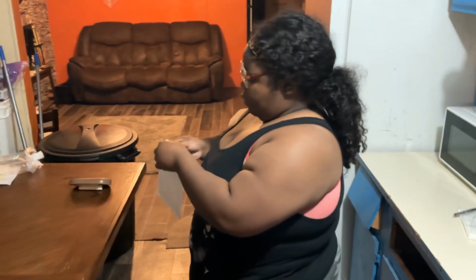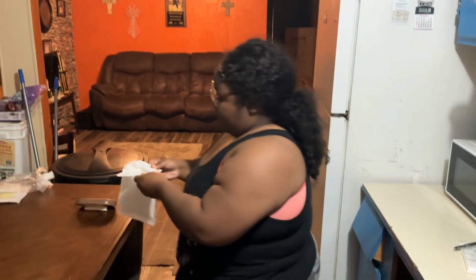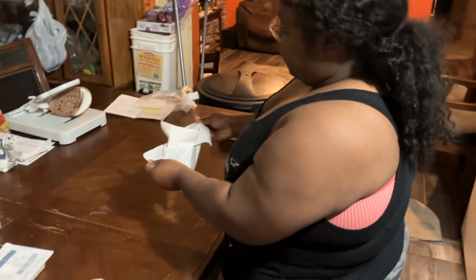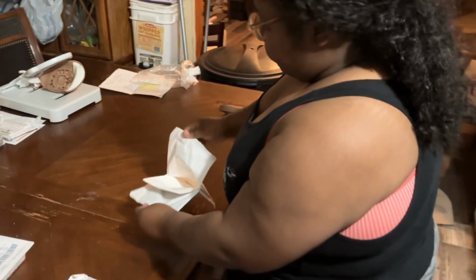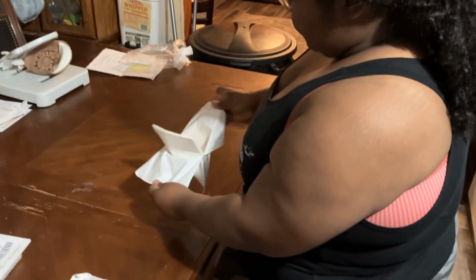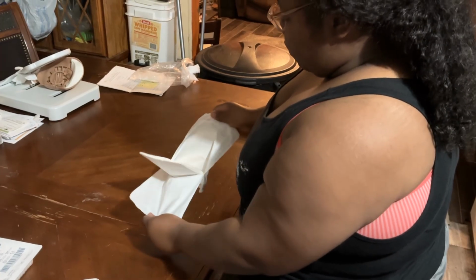I'm going to step back. Also, I want to keep in mind that in the real world, I would have a bedside table and my hands would not fall below my waist once I became sterile.